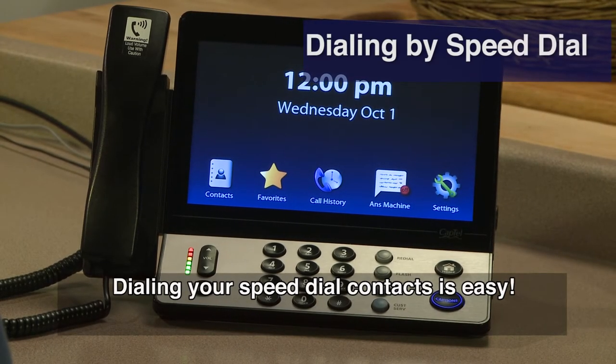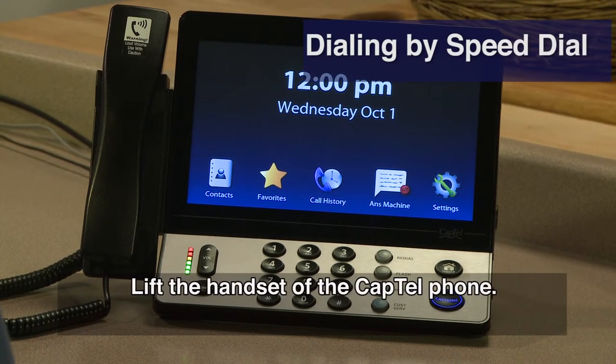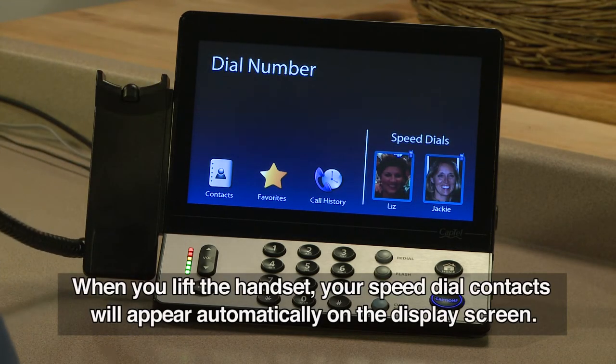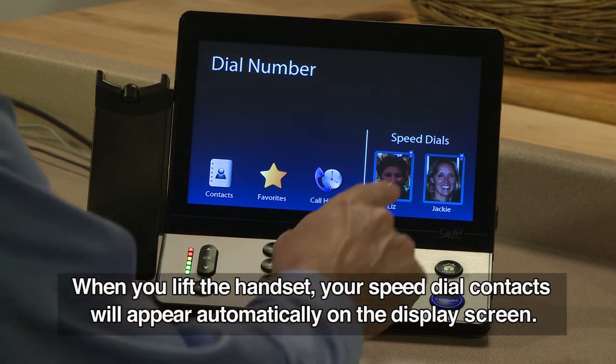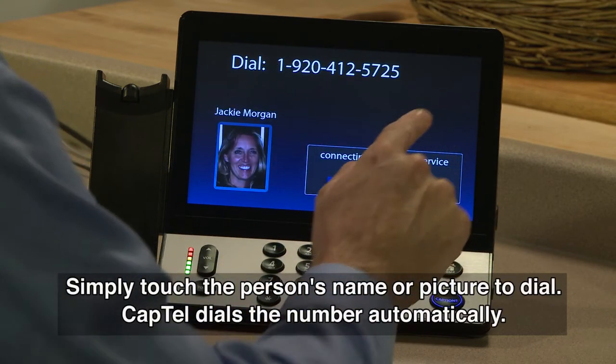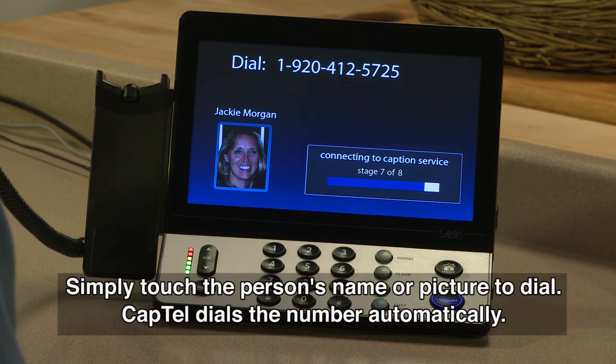Dialing your speed dial contacts is easy. Lift the handset of the CAPTEL phone. When you lift the handset, your speed dial contacts will appear automatically on the display screen. Simply touch the person's name or picture to dial. CAPTEL dials the number automatically.